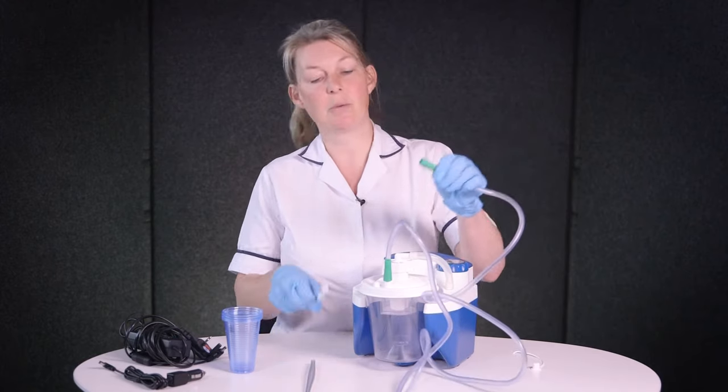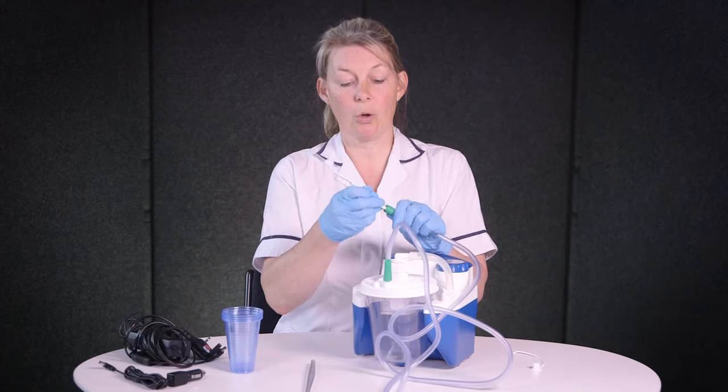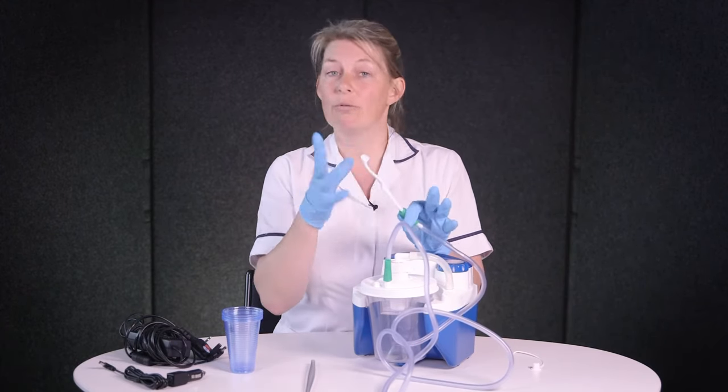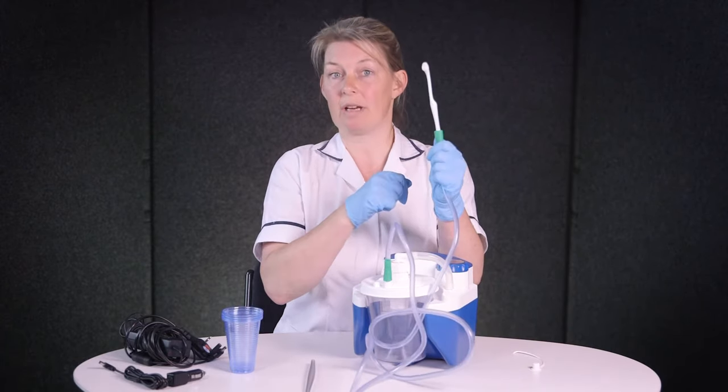Sometimes we also supply suction toothbrushes, which are quite handy. They've got a suction hole through them so when you're brushing the teeth it just takes away any excess froth or saliva — they just go straight in the end of the tubing.